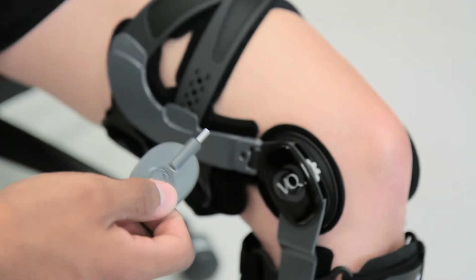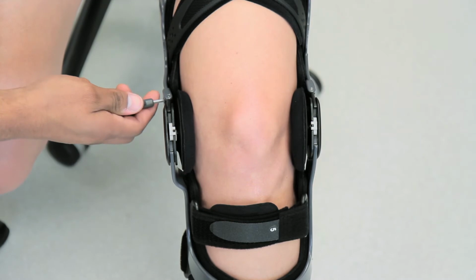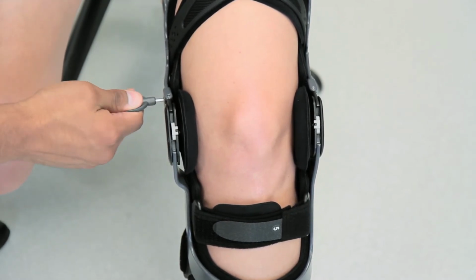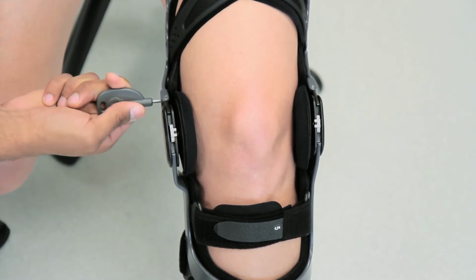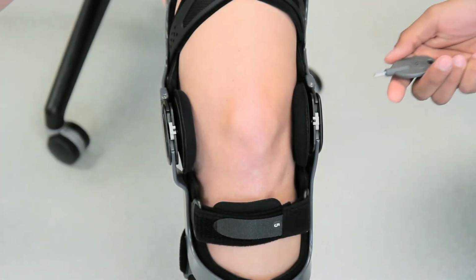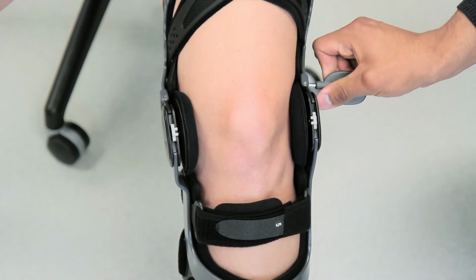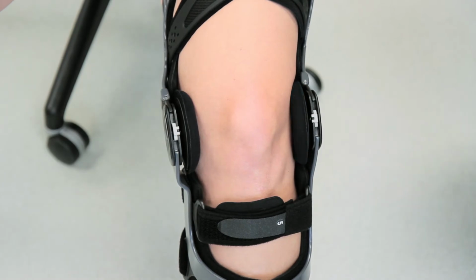While sitting, insert the patient adjustment key into the Q-hinge on the medial or inside of the knee and turn a quarter turn clockwise. This should open up the compartment and pull the hinge away from the leg. Then insert the patient adjustment key into the Q-hinge on the lateral or outside of the knee and turn a quarter turn counterclockwise. This should push the condyle pad into the knee and apply a gentle pressure or correction to the knee.